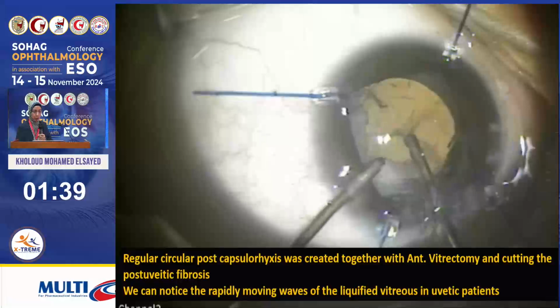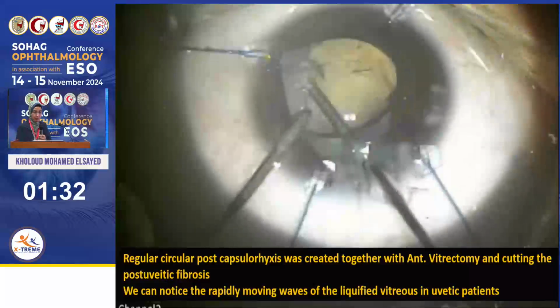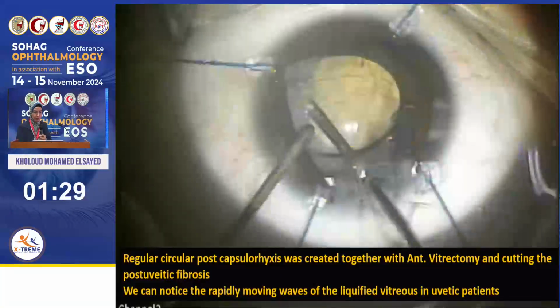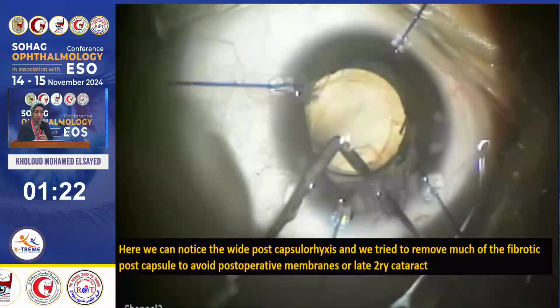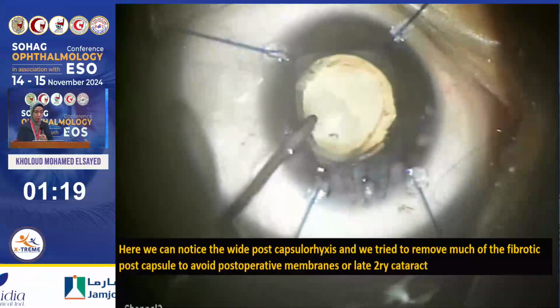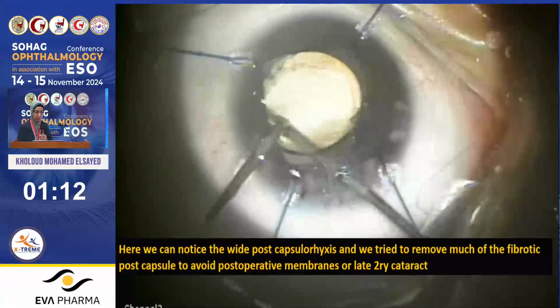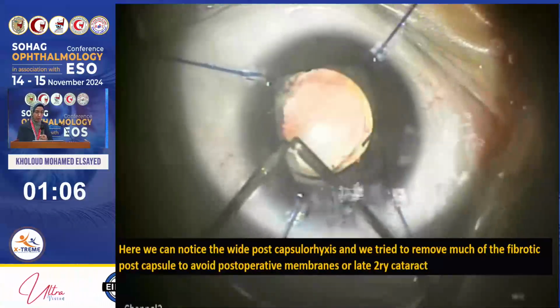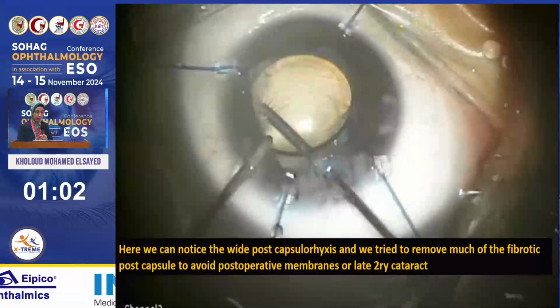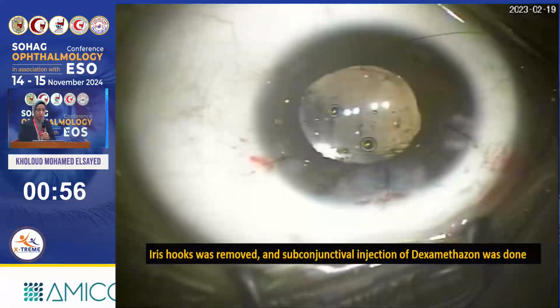We can notice the rapidly moving waves of the liquefied vitreous in uveitic patients. Here we can notice the wide posterior capsular rhexis, and we try to remove much of the fibrotic posterior capsule to avoid postoperative membranes or late secondary cataract. Posterior capsular rhexis and anterior vitrectomy were finished. Iris hooks were removed and a subconjunctival injection of dexamethasone was done.